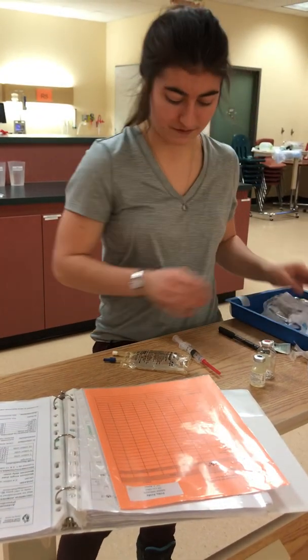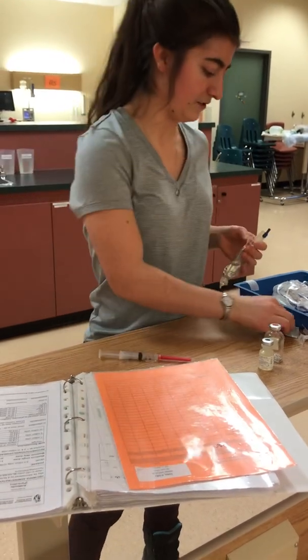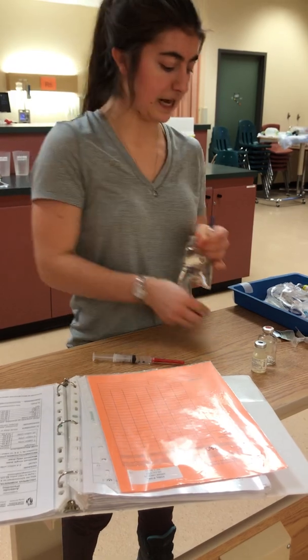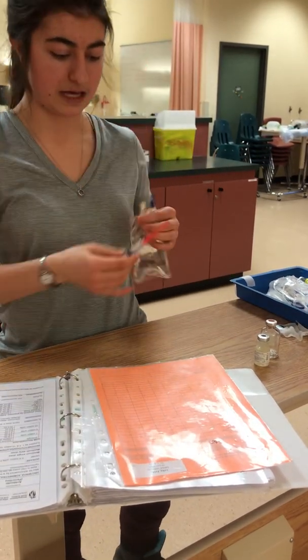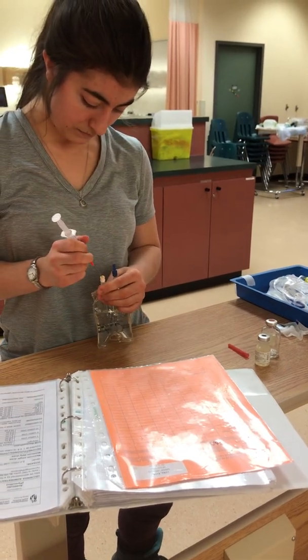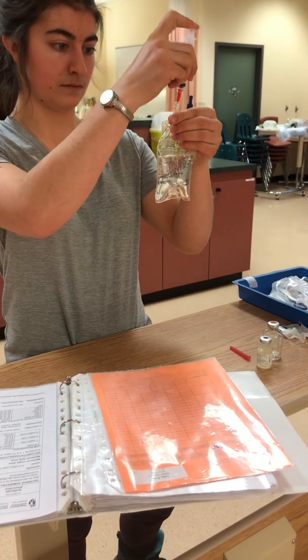Okay, so now I am going to get my stuff ready. No, I'm not. I'm going to finish putting this in here. So I'm going to swab my port with a clean swab for 30 seconds, let it dry for 15. I'm going to put my 3 mils of my penicillin G in here. This goes back to the sharp side. I'm just going to gently mix that.